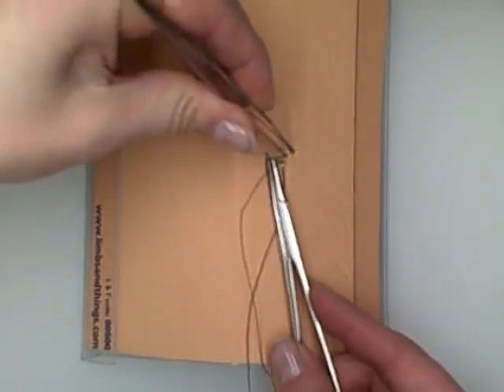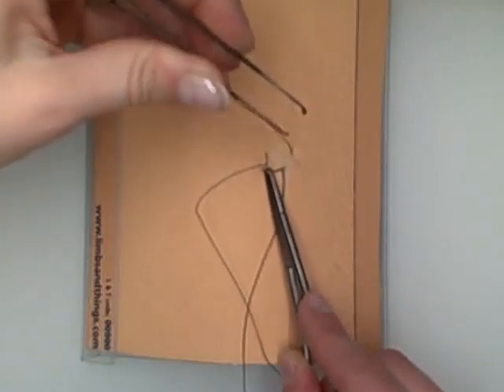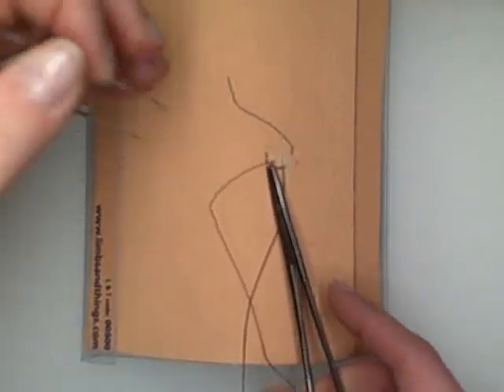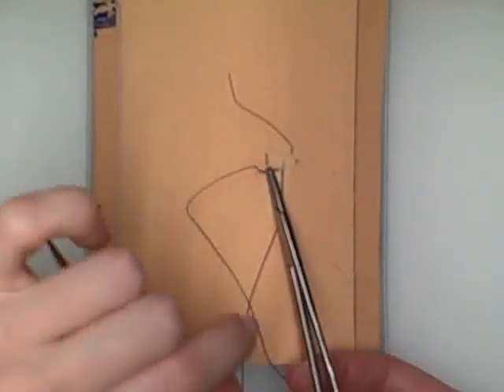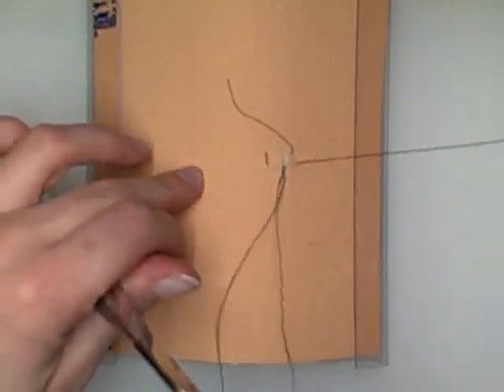The horizontal mattress, it's really good for thin skin. Like when you're suturing on a finger or the web space. It's also used in the scalp sometimes.